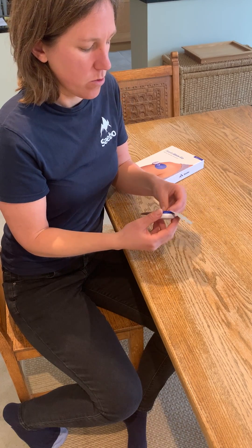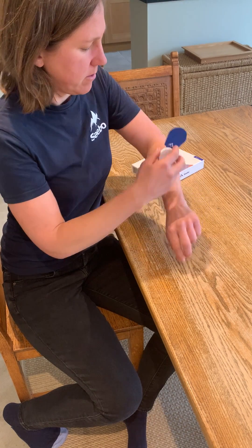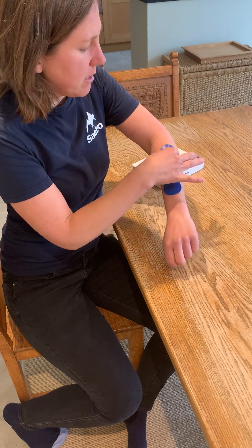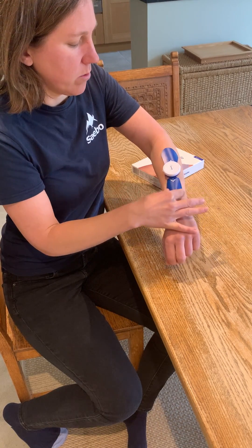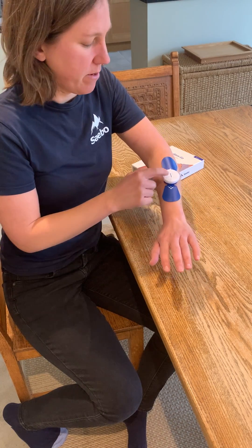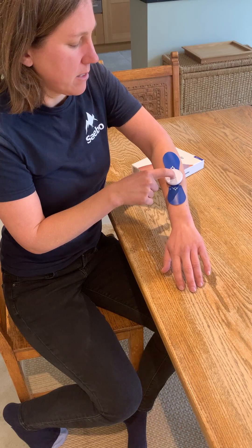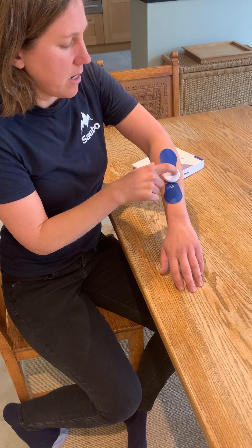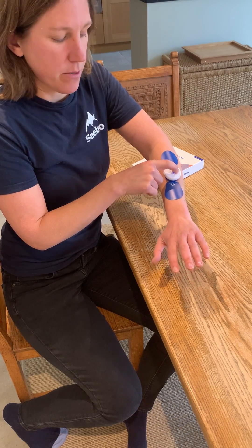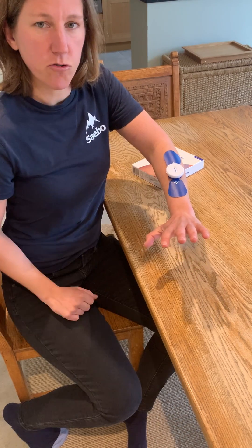You don't need to work out any settings. All you need to do is peel off the clear plastic protective coverings, stick it to the muscle that you want to work — in this case the muscle that's going to take my wrist back and open my fingers — then press the power button until it beeps, and press the two dots to turn the stimulation up. That's making my muscle contract.